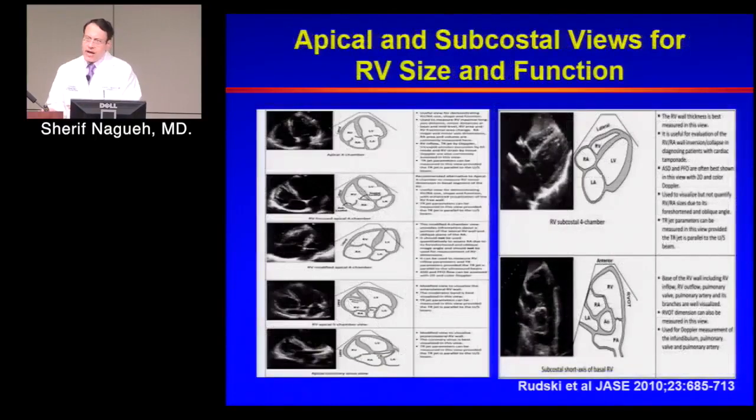So we leave the short axis views and now we go to the apical views. This is the standard apical four-chamber view. And as you see, the apical four-chamber view shows you the LV well and is ideal to get LV volumes, ejection fraction, etc. But it is frequently not the best look at the RV. And sometimes we need a focused RV view and sometimes a modified four-chamber view. I'll speak quickly about the modified because I want to spend more time on the RV focused view.